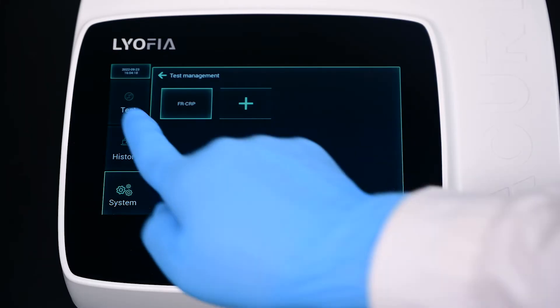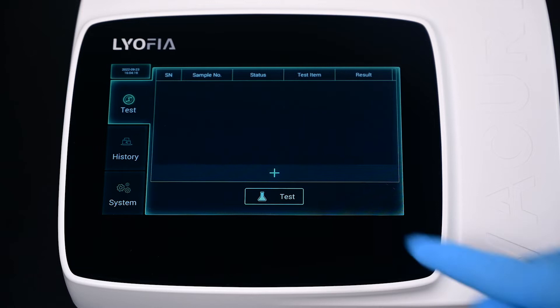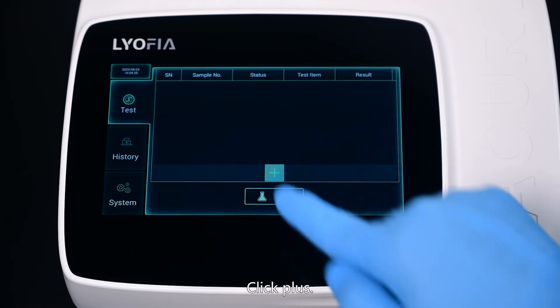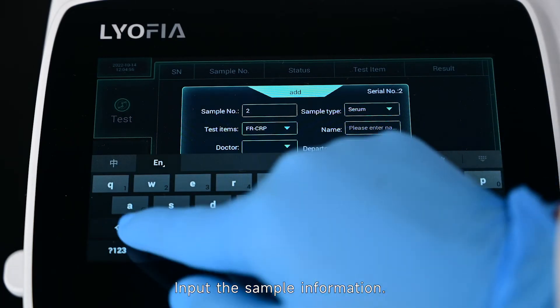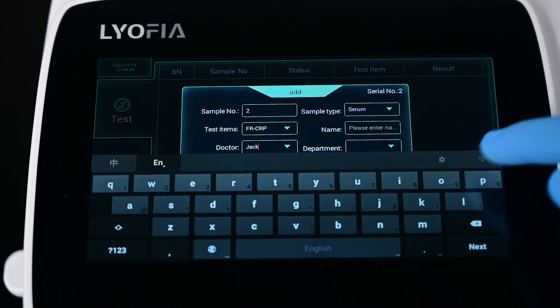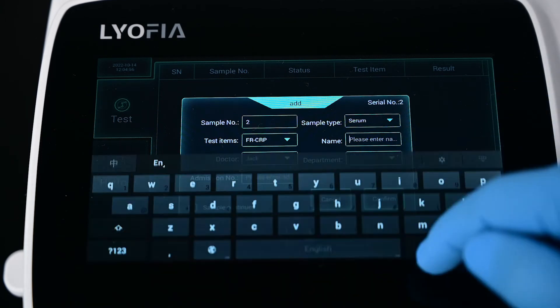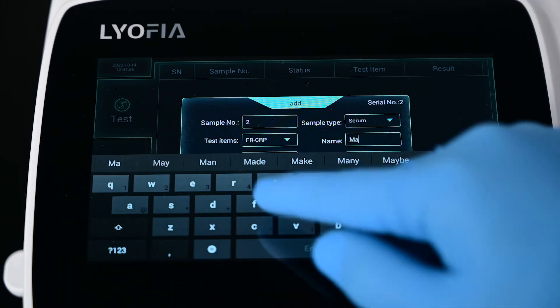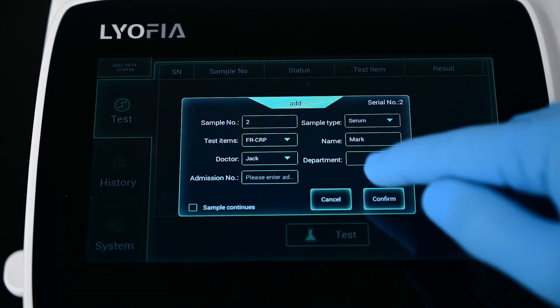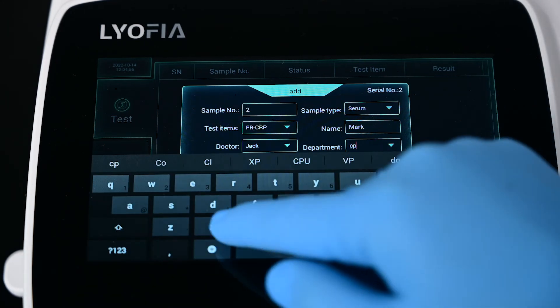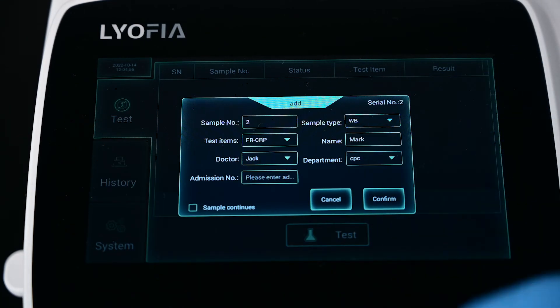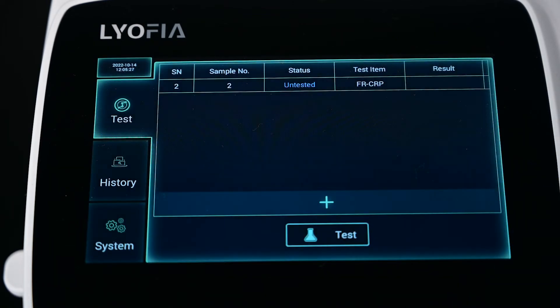Click Test, then click Plus. Input the sample information and click Confirm.